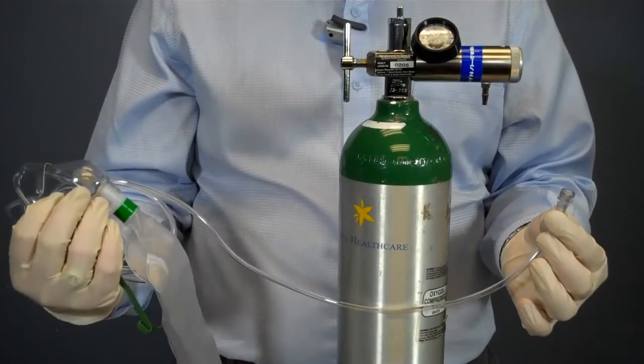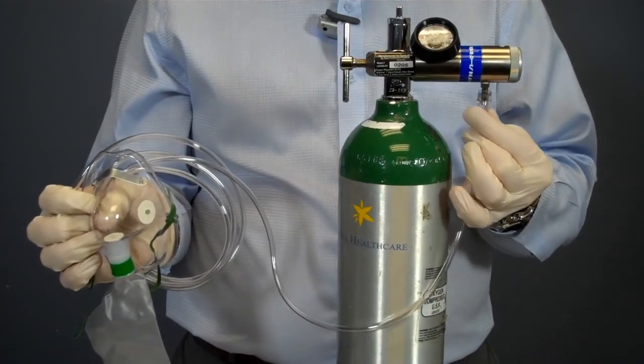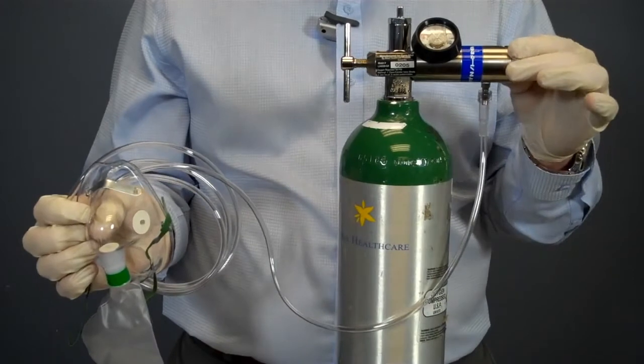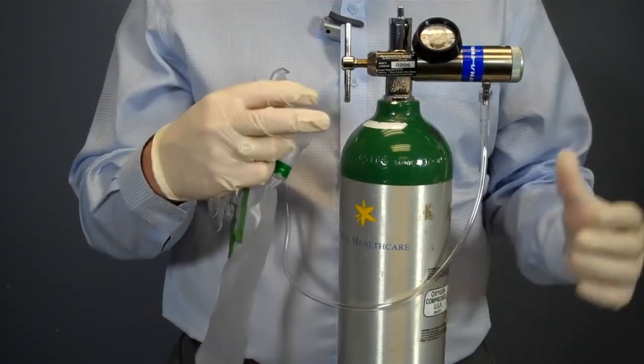Now I need to attach a non-rebreather mask to the tank and prepare it for patient use. After checking the packaging and mask for tears, punctures, or missing pieces, I pull out the tubing and attach it to the port valve on the regulator.